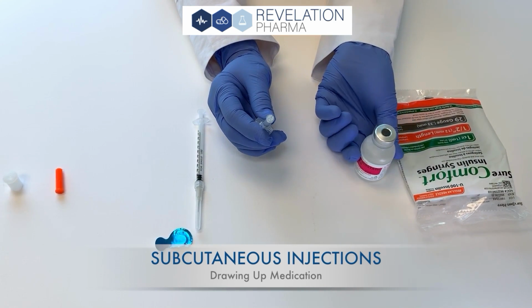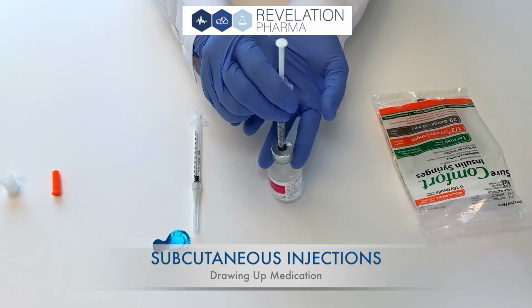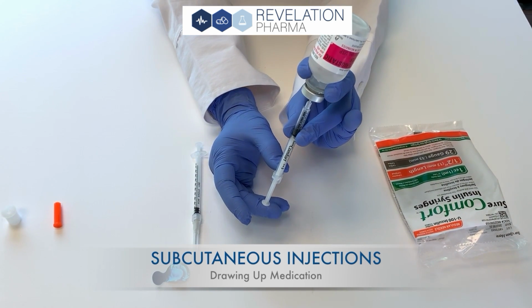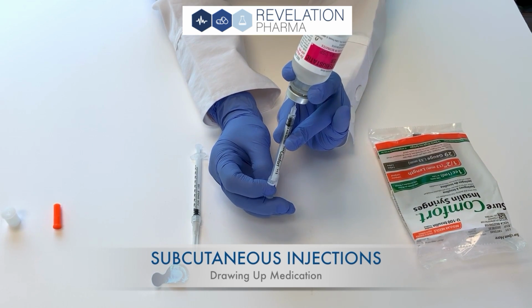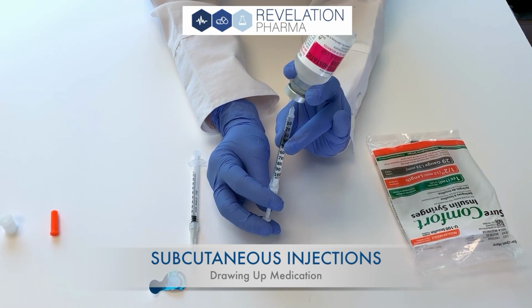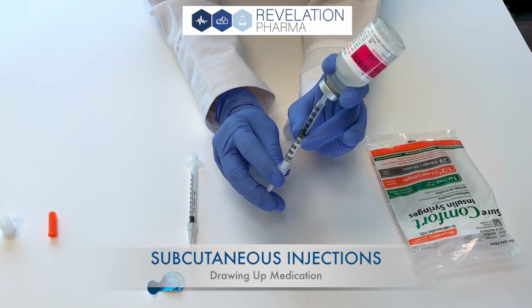At this point, push the top of the needle into the rubber stopper, invert the vial, inject the air into the vial, and pull back down to your specific dose. Make sure the tip of the needle is underneath the surface of the medication so you don't pull back air.